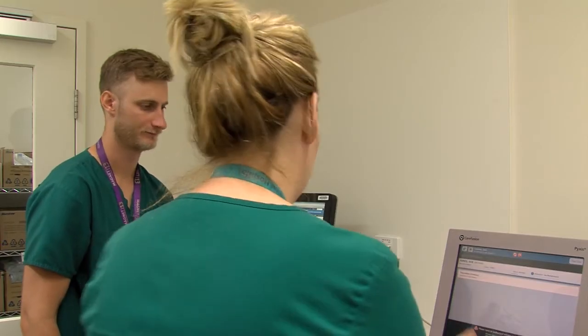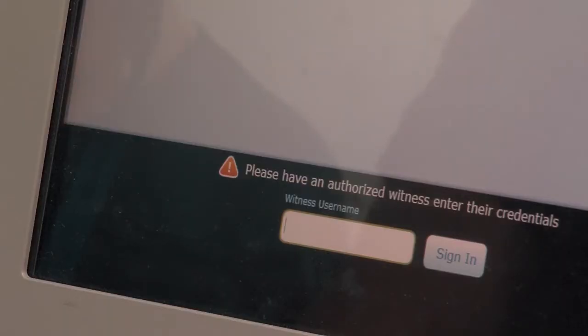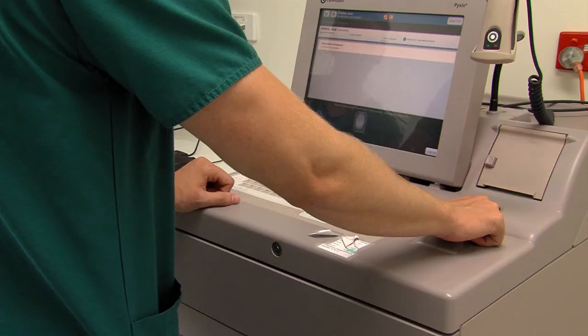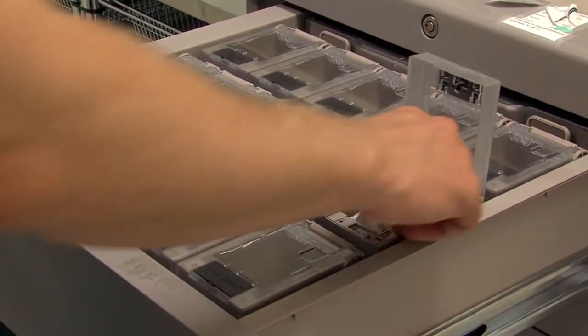Because Endone is a Schedule 8 medication, the med station will prompt for a nurse witness. The nurse witness will type in their Novell ID and either their password or scan their fingerprint. The Pyxis drawer and QB pocket inside will open.